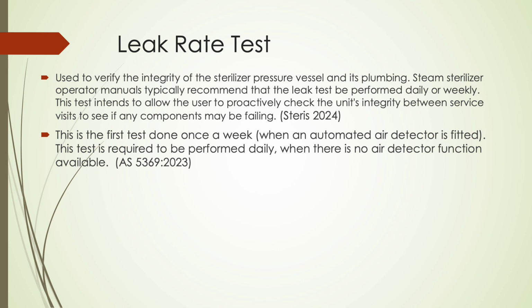The first performance test is the leak rate test. The leak rate test should be completed prior to the Bowie-Dick test cycle. It should be completed once a week as the standard's minimum requirement if an air detector system is fitted. If there is no air detector system in the sterilizer, the leak rate test should be done daily as per standards.